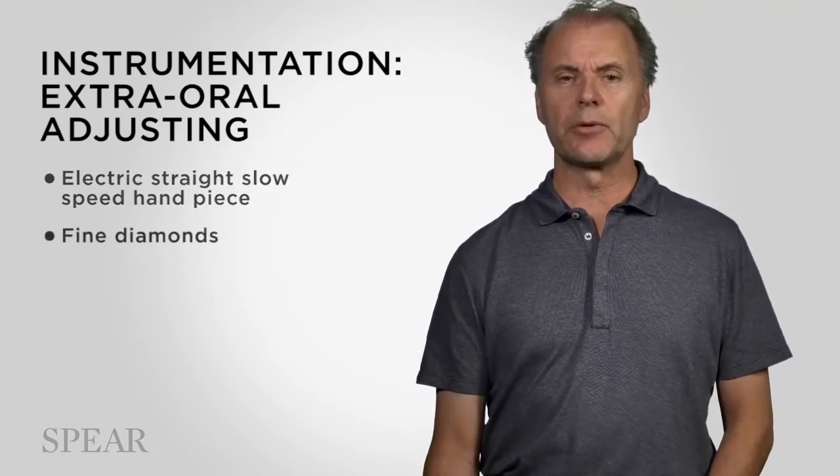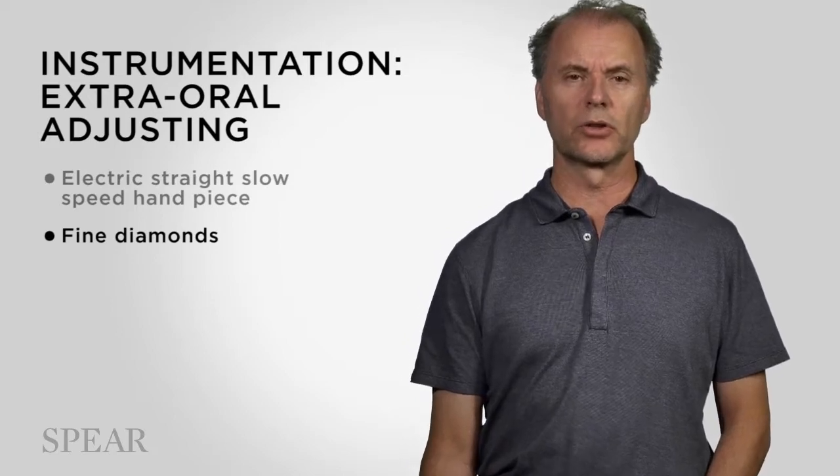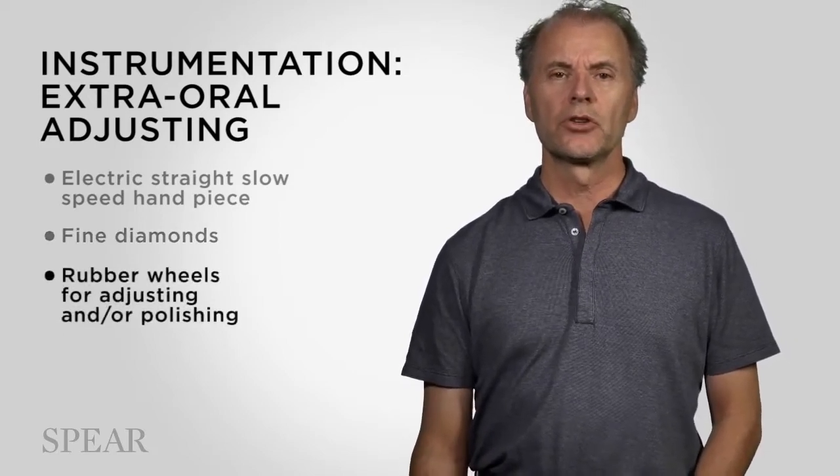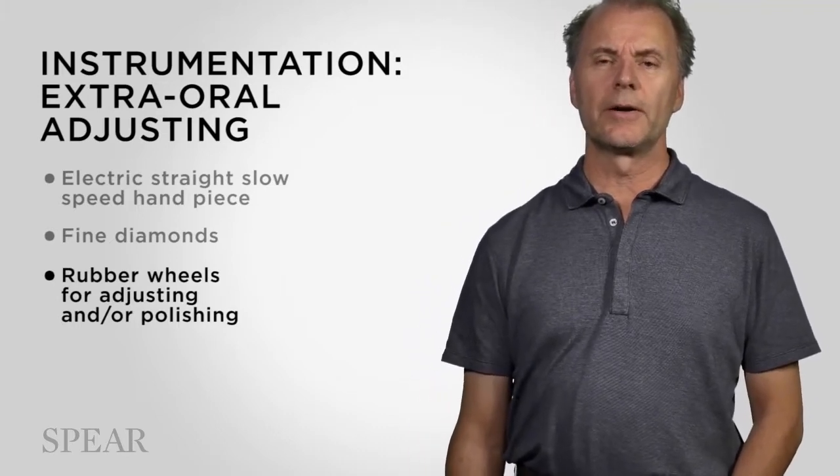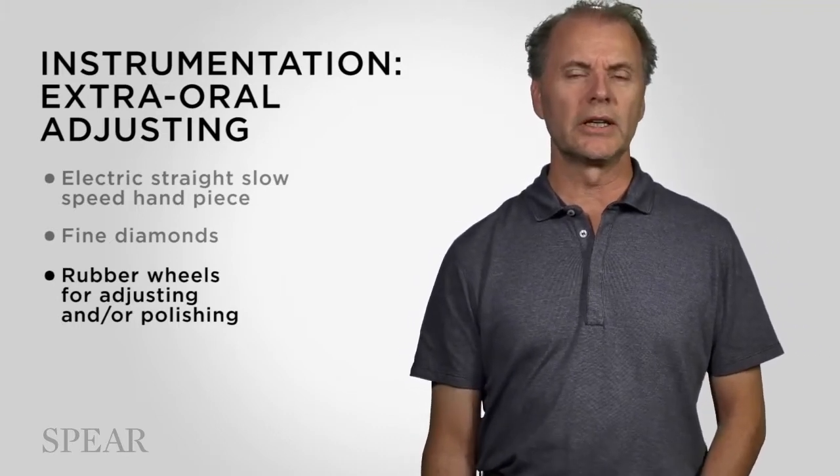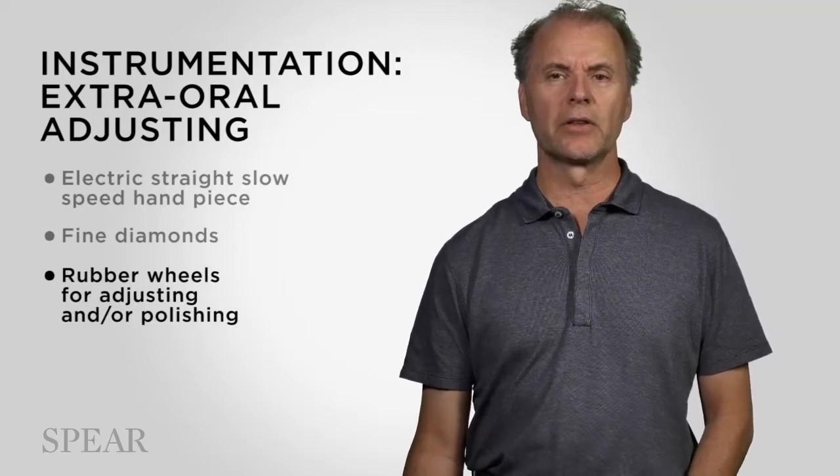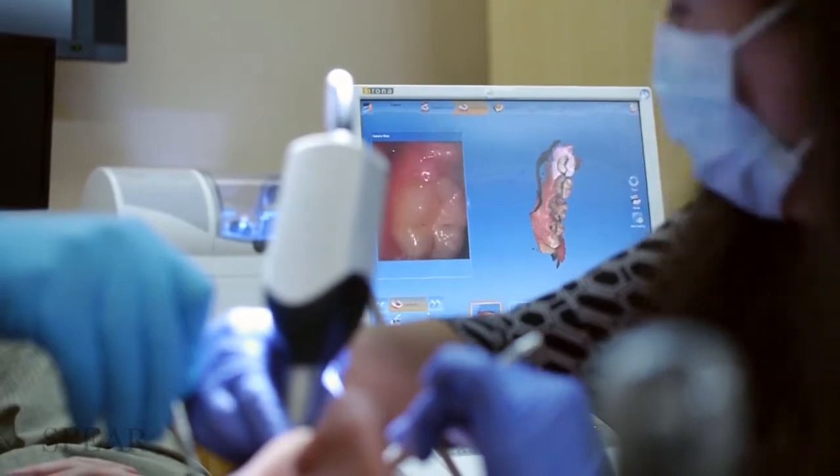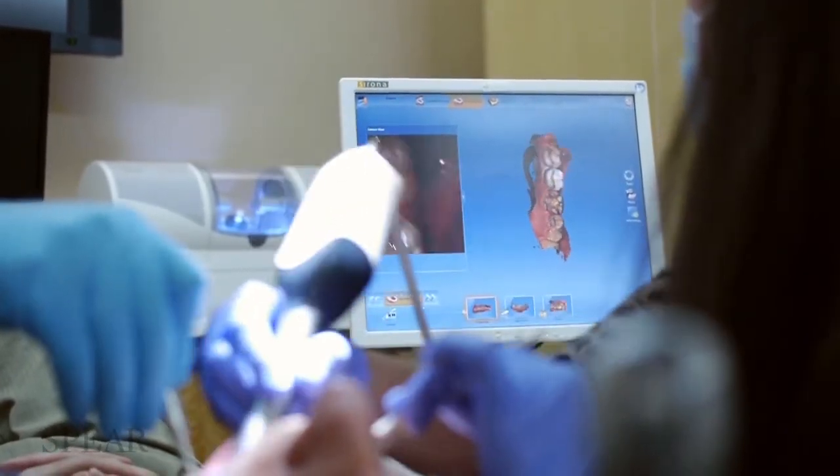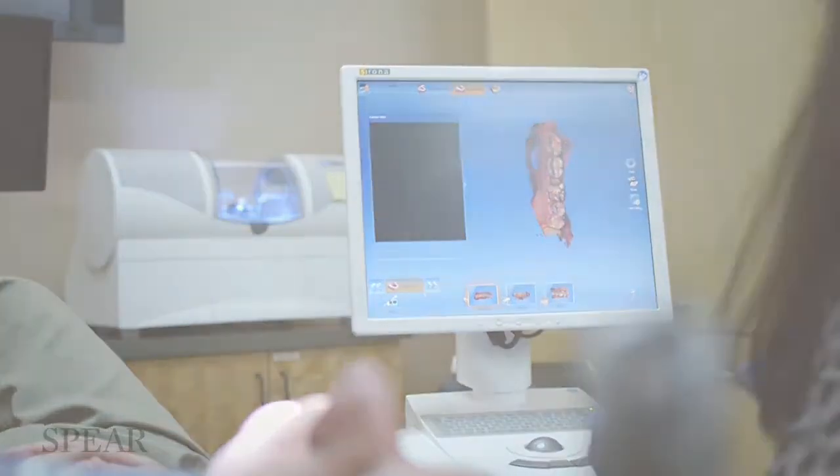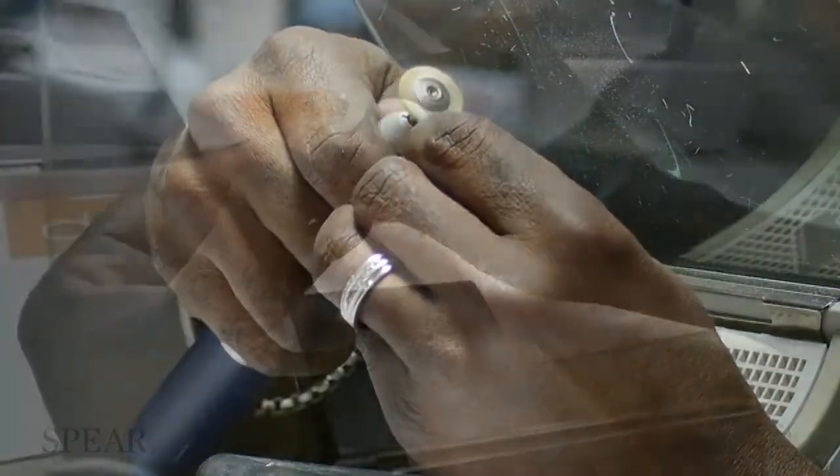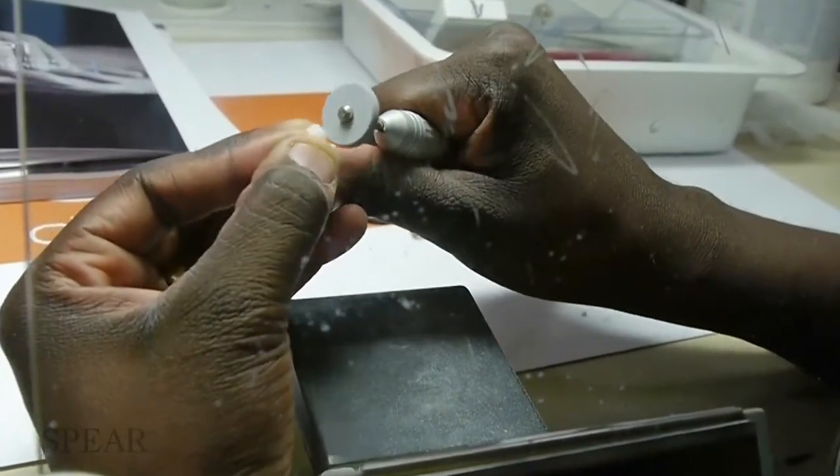We'll talk about the diamond burrs to use, and the strong suggestion will be fine diamonds, and then the rubber wheels. If you think about what's happening extra orally, it's no different than what would happen in the laboratory. If you're doing in-office milling, you're doing probably some of these procedures as routine. But if you're not doing in-office milling, many clinicians are almost afraid to grind on or adjust ceramic because we're uncertain on how to manage the technique.